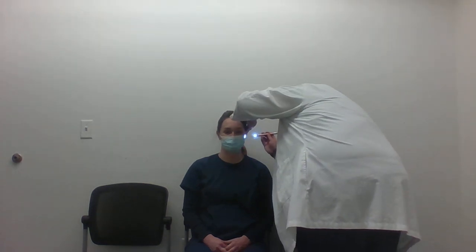Patient denies any pain or tenderness when I feel her ears. I'm going to go ahead and lift on your ear canal. I'm going to pull up and back and looking down. And on this side. There is a little bit of fluid, but there is no drainage in her ears.